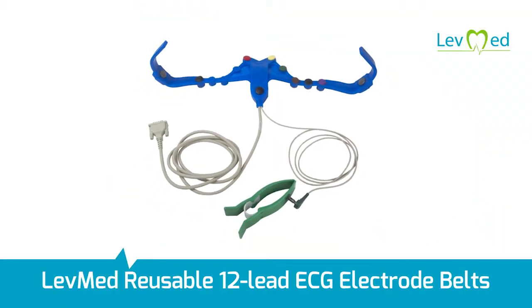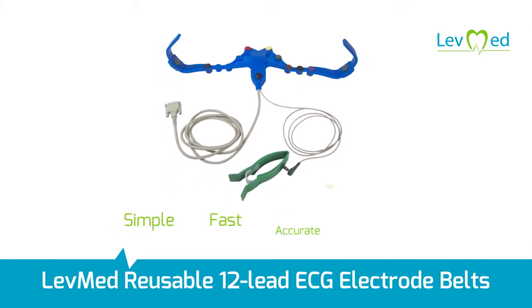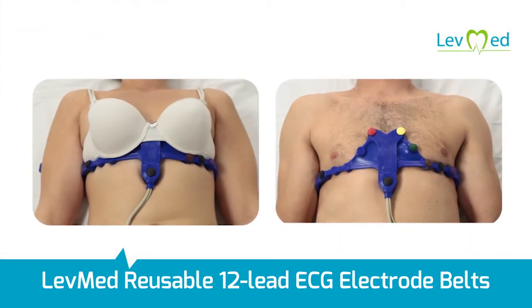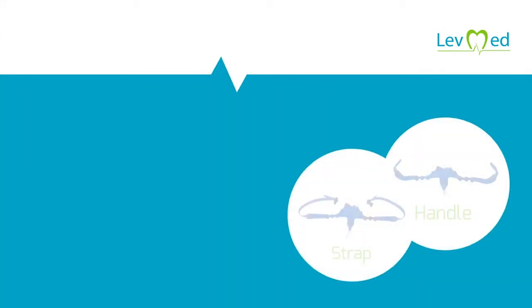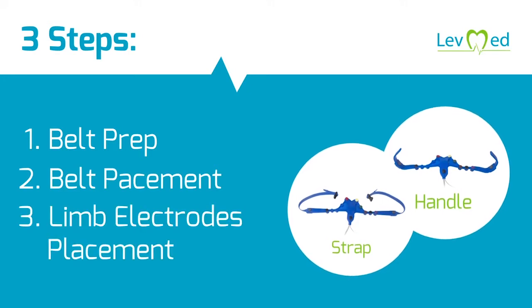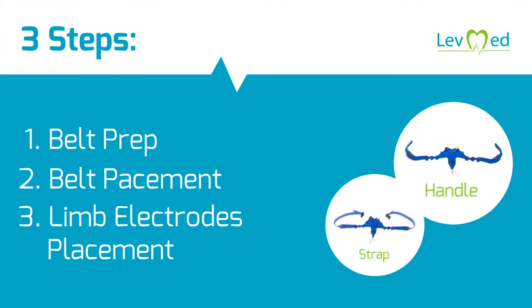LevMed reusable 12-lead ECG electrode belts enable simple, fast, accurate and reliable assessments for both men and women of all body shapes and sizes. This video will demonstrate the three-step application process of the two LevMed dedicated ECG belt models: the dedicated strap and the dedicated handle.